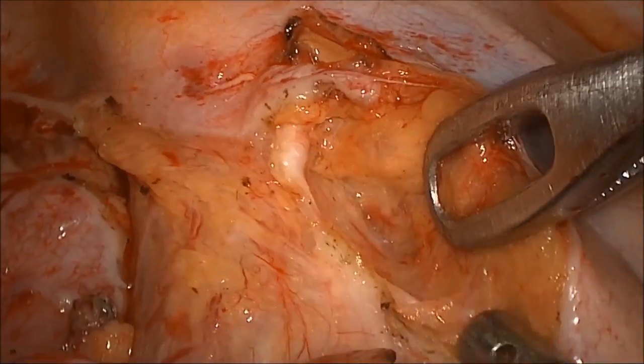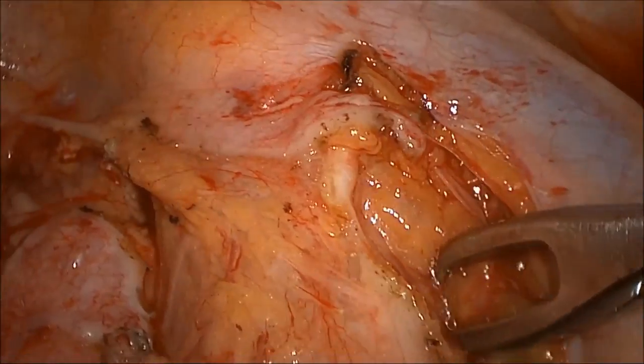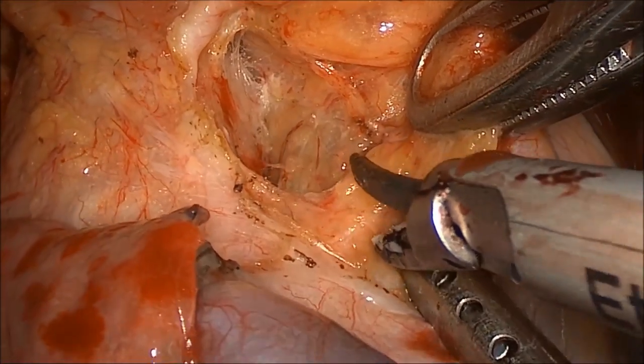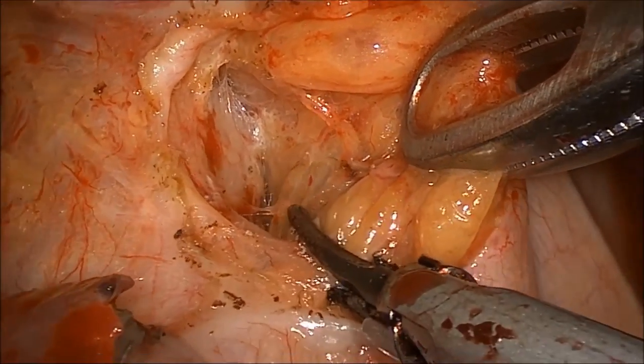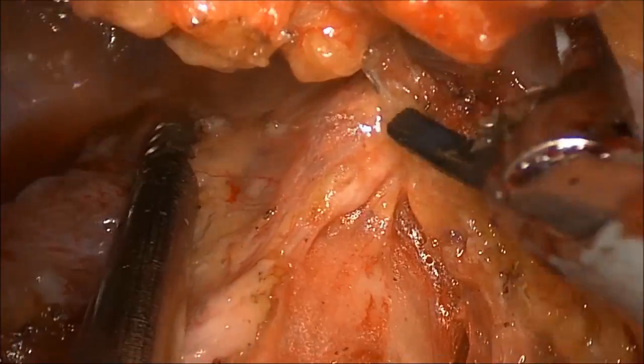For mid-thoracic tumors, typical of squamous cell carcinomas, or if there is suspicion of lymph node involvement, 3P — also known as upper posterior mediastinal lymph nodes — and paratracheal lymph node stations are resected.